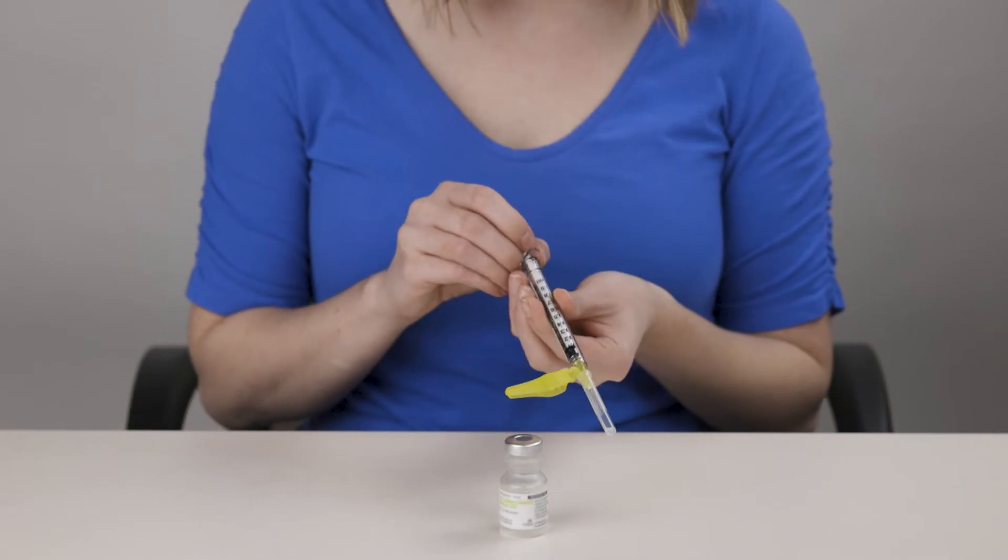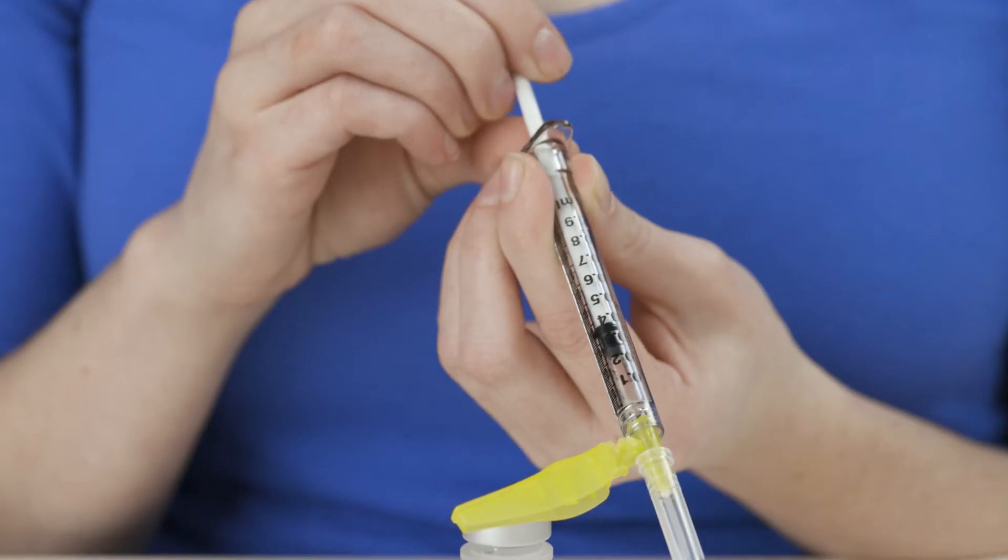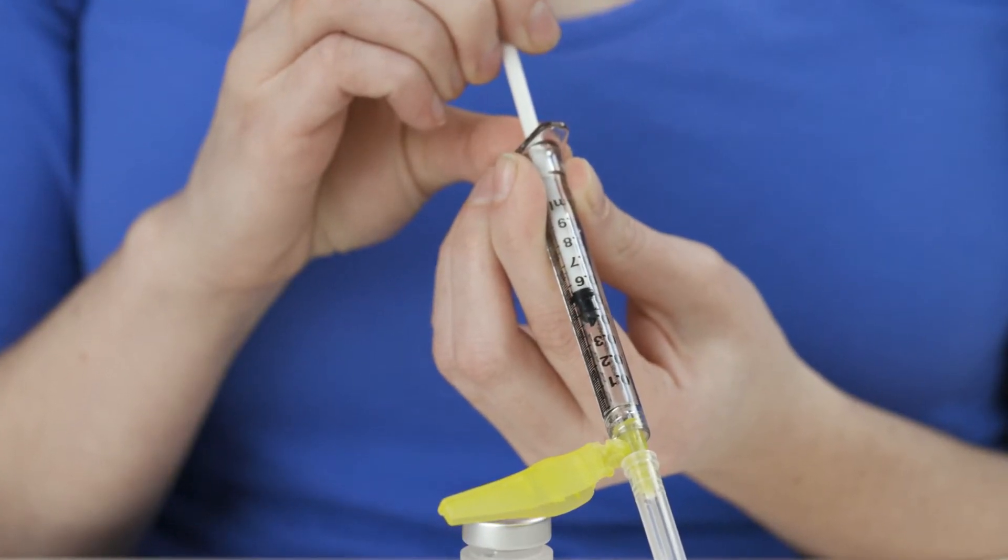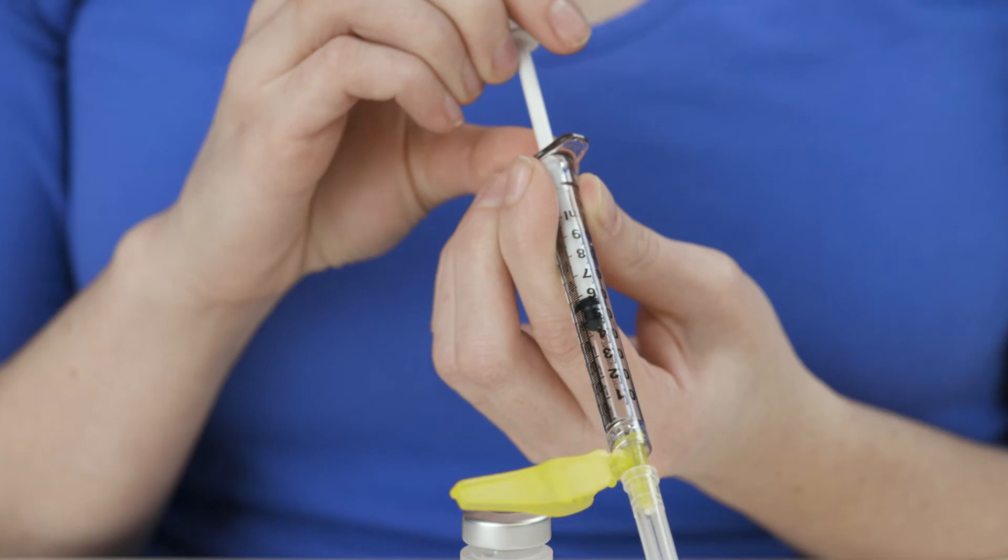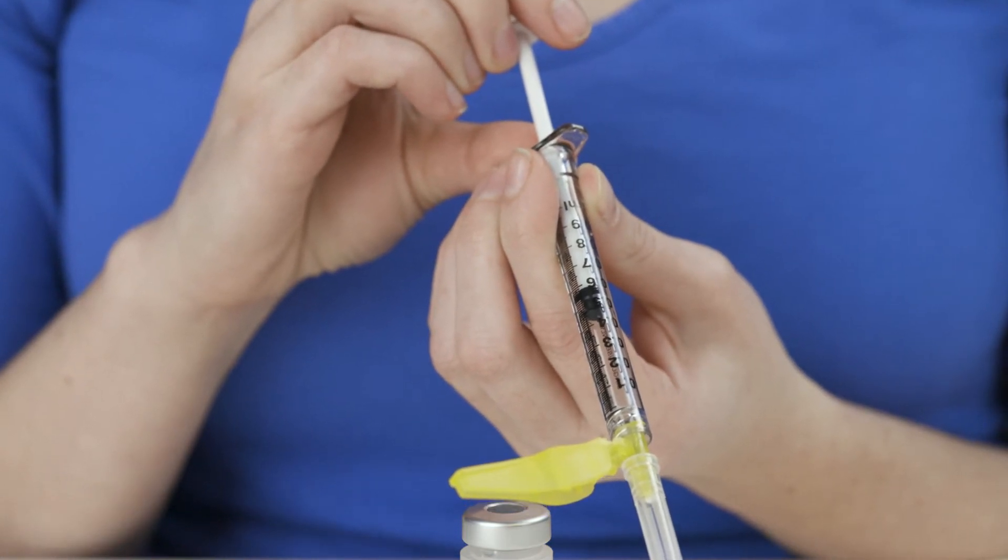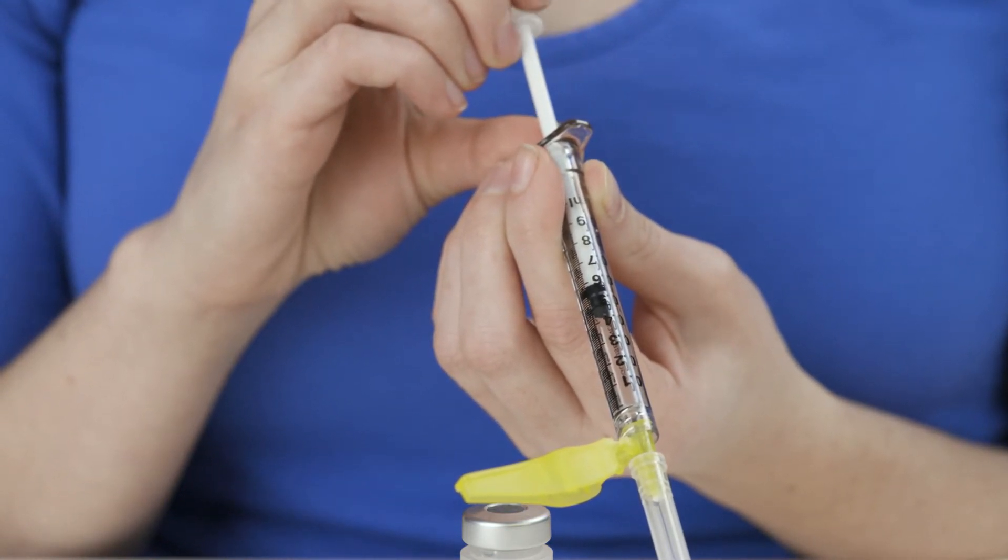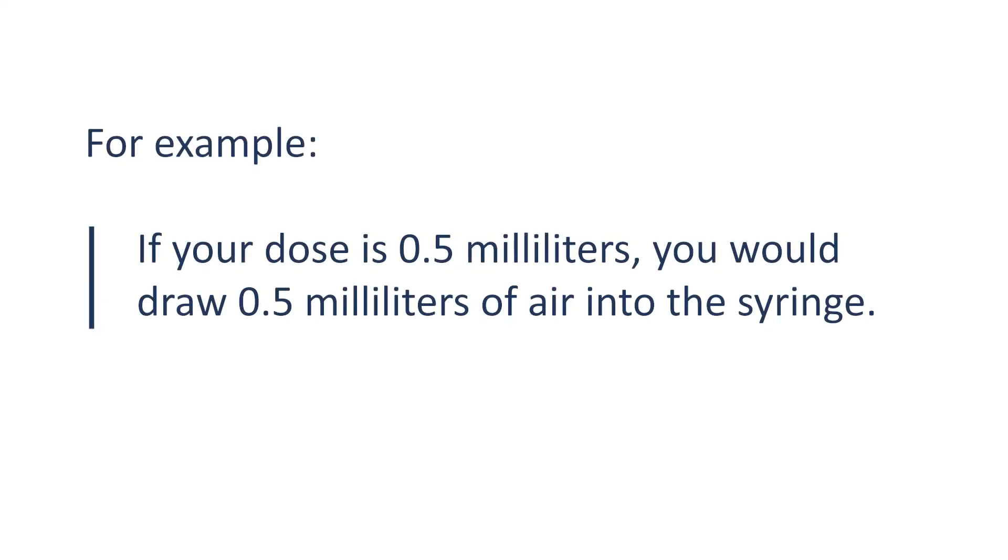With the needle cover on, pull back the plunger and draw air into the syringe. The amount of air you draw into the syringe should equal your dose of medication. For example, if your dose is 0.5 mL, you would draw 0.5 mL of air into the syringe.